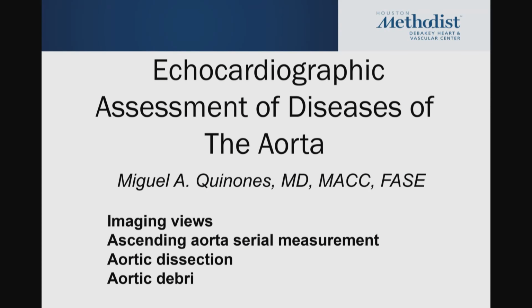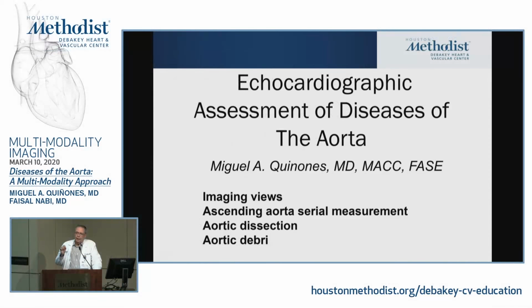However, we cannot ignore echo for two reasons. One is frequently it's the first imaging that is done in a patient, and then an aneurysm is detected. So it's the first imaging technique that frequently detects a silent aneurysm. Number two, in the absence of gated CT and CMR, if you practice in a place that does not have those, TEE is superior to conventional CT by a radiologist without gating.